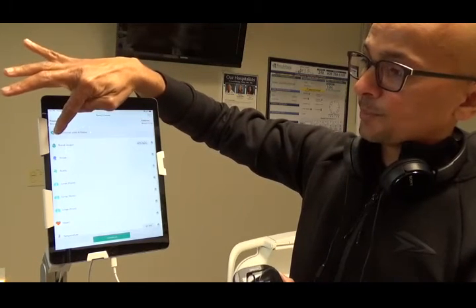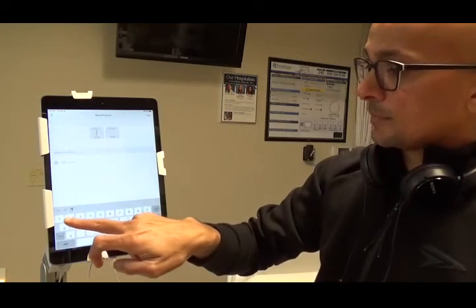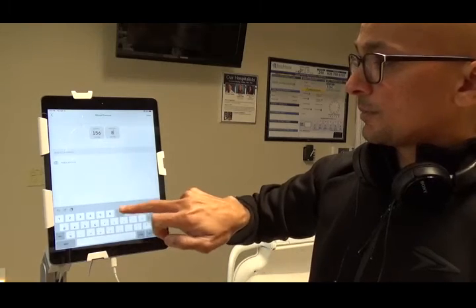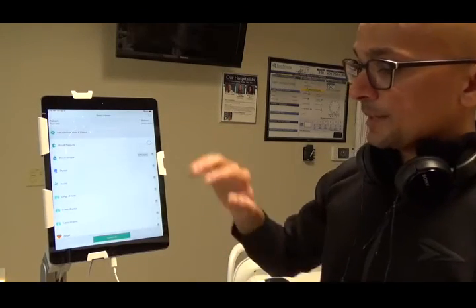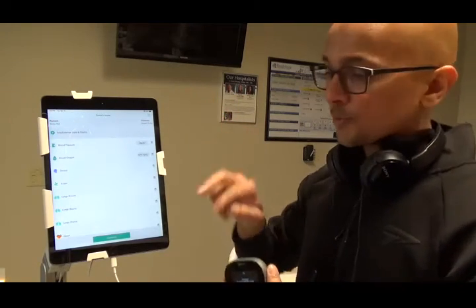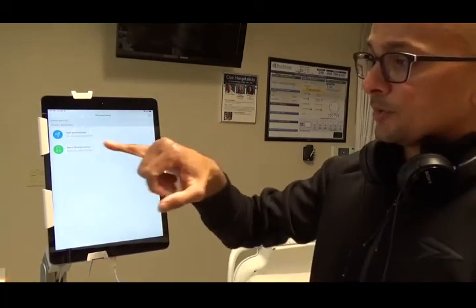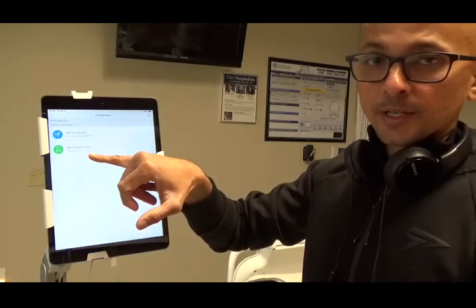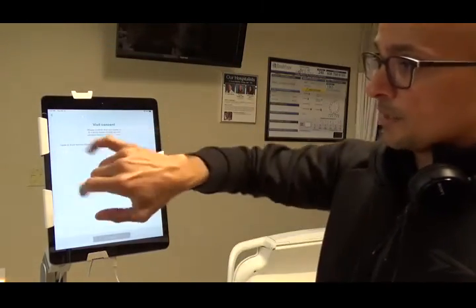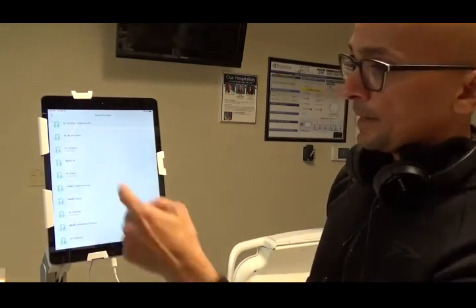We'll also add blood pressure. Okay. Now, all of this is your whole physical exam dashboard, and then you click continue. It's saying uploading exam, send to clinician or see a clinician online. In this case, we're going to send it to the clinician. Send to clinician. Making sure the patient has given you the consent. Confirm.